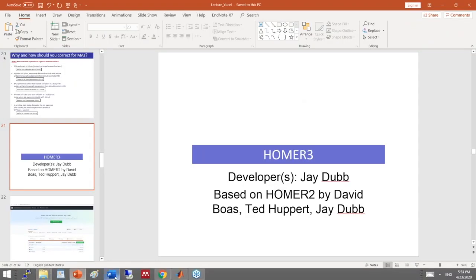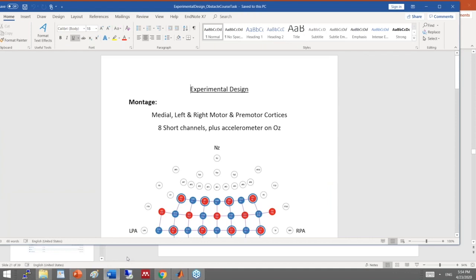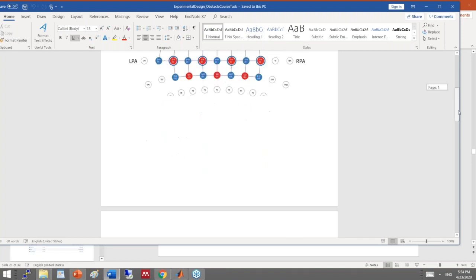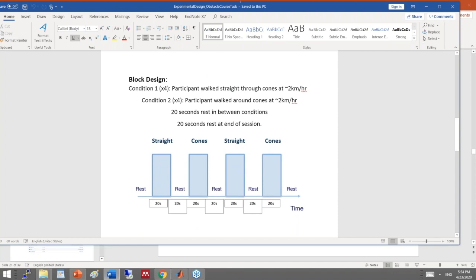I will use a dataset, and the details are not that important because I will mostly focus on motion correction, not estimating HRF. We have this frontal probe with channels shown in purple — reds are sources and blues are detectors. This is our probe design. The task has two conditions, with a rest period of 20 seconds.